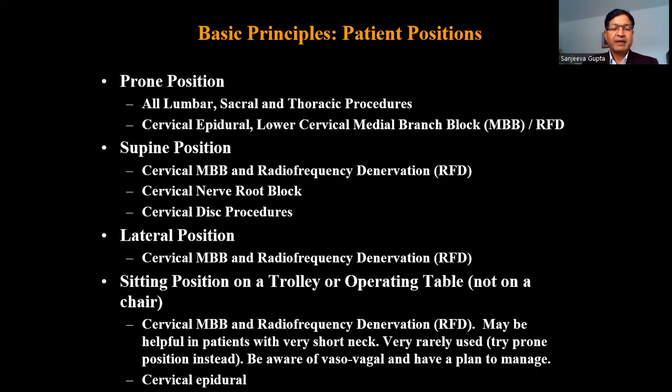It's not ideal. So cervical medial branch block and radiofrequency denervation may all be done in sitting position. Cervical epidural can also be done. As I said, if you do want to do it in a sitting position, do it with the patient sitting on a proper trolley or an operating table so that in case there's any problem, you can lie them supine.